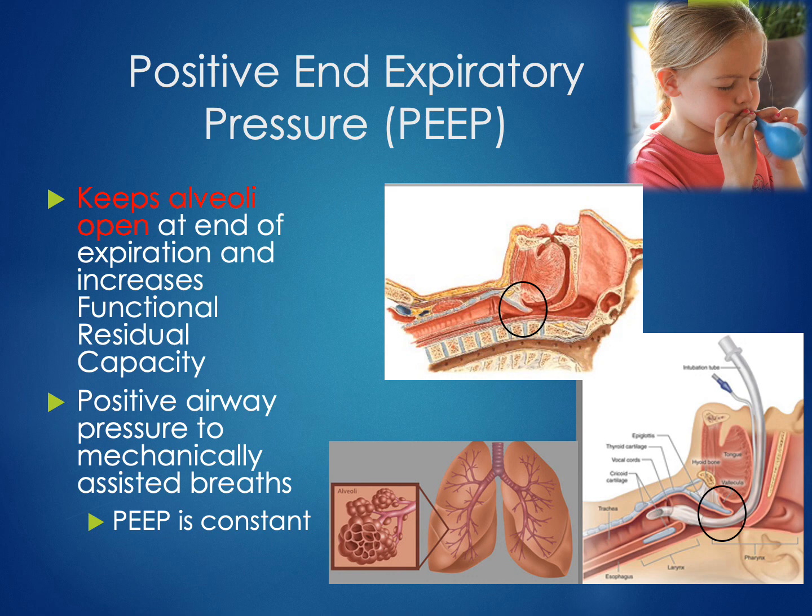So in a sense, after exhaling, the machine needs to make sure that there's still some pressure in the lungs so that they don't collapse. And this is called positive end expiratory pressure, or PEEP. That positive pressure applied on the patient's lungs to keep them open after exhaling. So PEEP keeps our patient's lungs from collapsing.